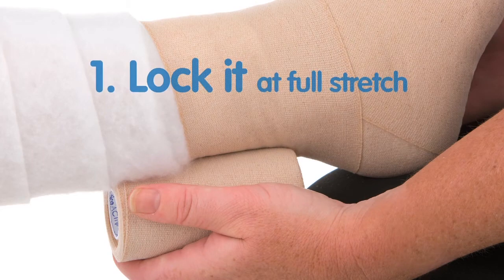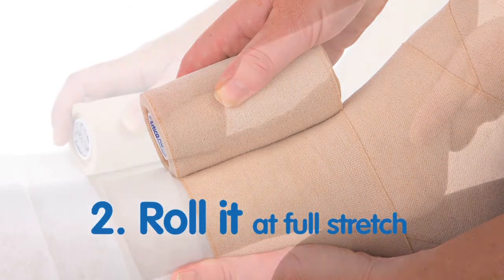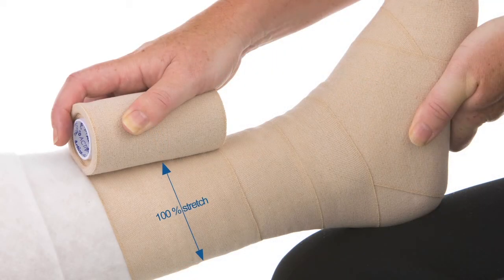You need to lock the Actico bandage out at full stretch on the limb and then roll it at full stretch around the leg in a spiral. Actico should be applied at 100% full stretch, always close to the limb, with a 50% overlap.